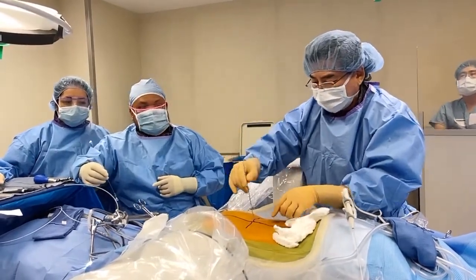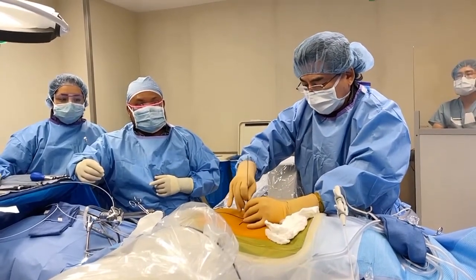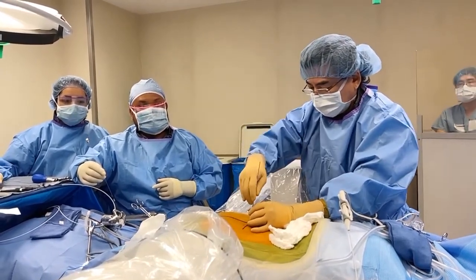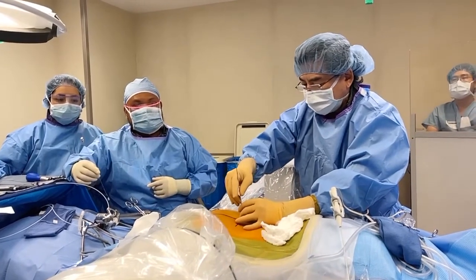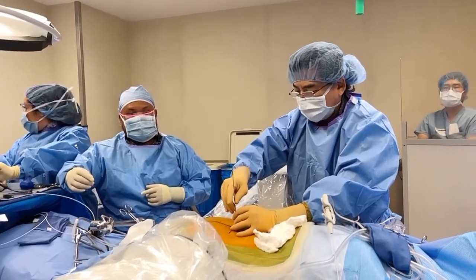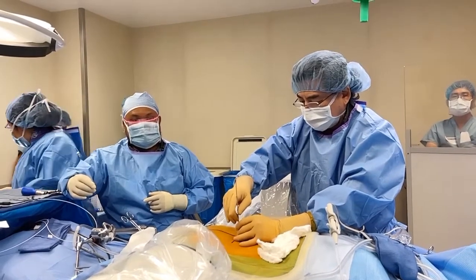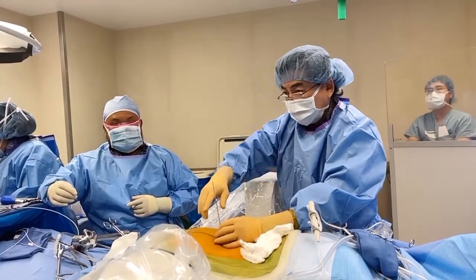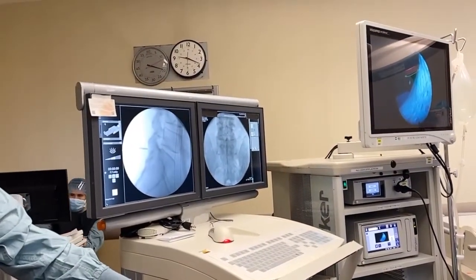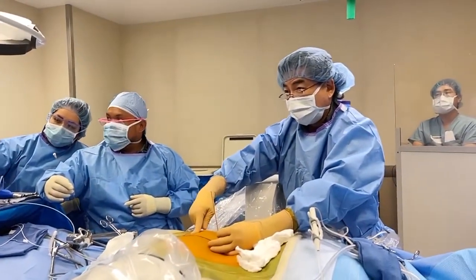Spaghetti noodle dilator. I'm gonna gently, carefully, with my pinky out, make my way down to the spine using a combination of intraoperative imaging. My Helen Keller fingertips, because I can feel everything. That's the inferior lamina, inferior edge of the L5 lamina, superior edge of the L6 lamina, interlaminar space, X-ray. Feel the interlaminar corner. And some of this is using the force, Luke, the force. Shot.